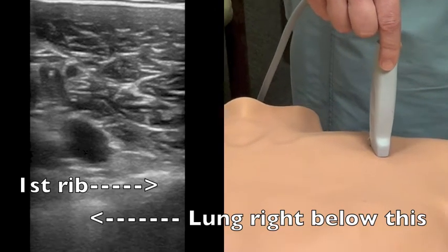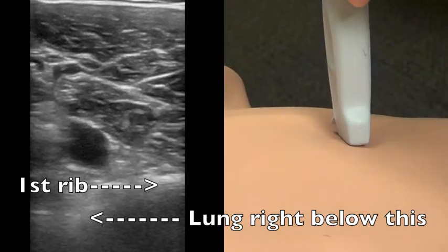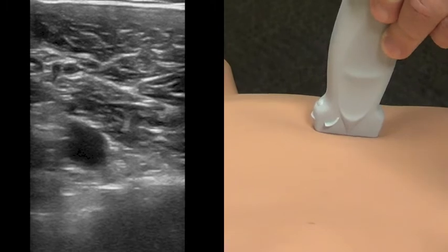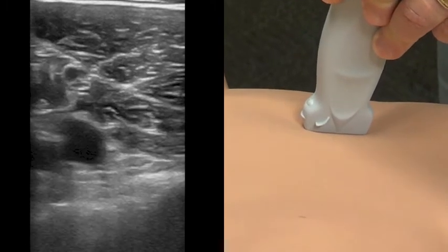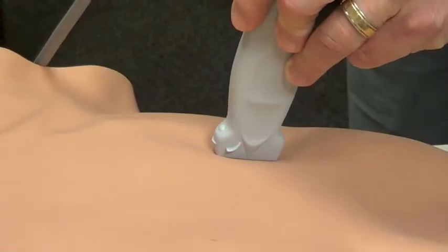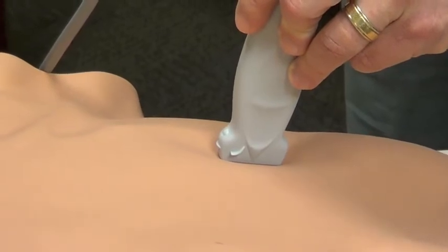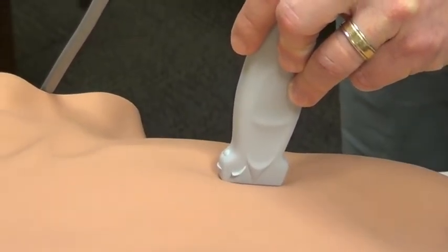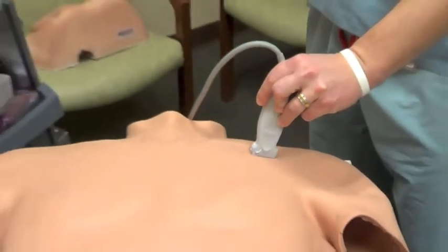From this position we can also turn the probe and visualize the vessel in long axis if we prefer. At this particular time there is no specific recommendation for long axis versus short axis views with an ultrasound-guided technique.